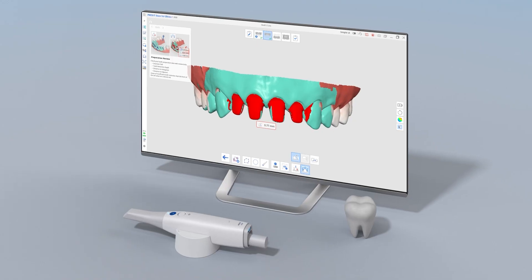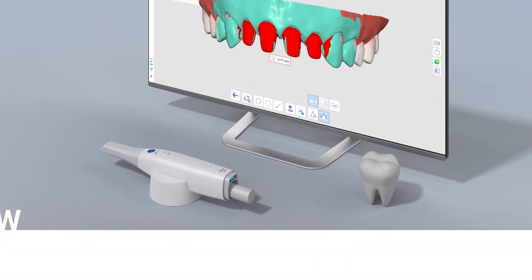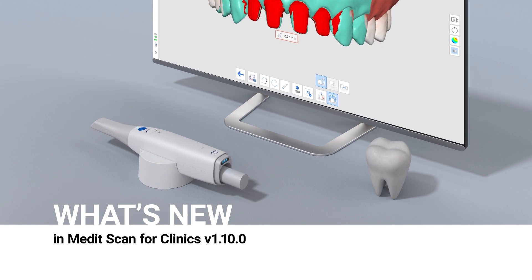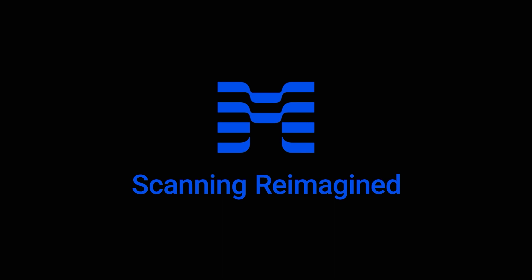This was a brief overview of what's new in MeditScan for Clinics version 1.10. Update your Medit Link now and see the release notes for more details.